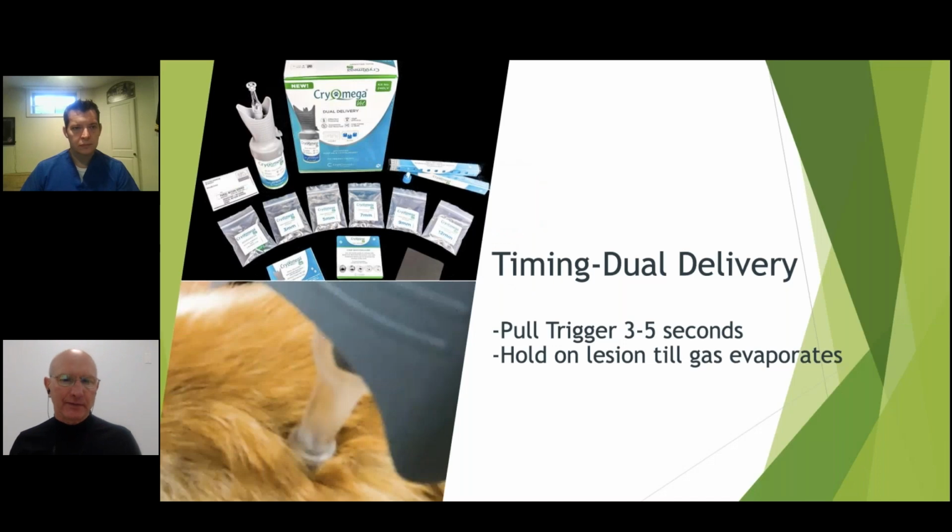For the dual delivery device, it's kind of the same thing. The dual delivery device works where, and I have one here because this is easy enough to do, you flip it upside down, there's a trigger on it that you pull, which dispenses the gas into the cone, and that's what's shown in the picture down below.